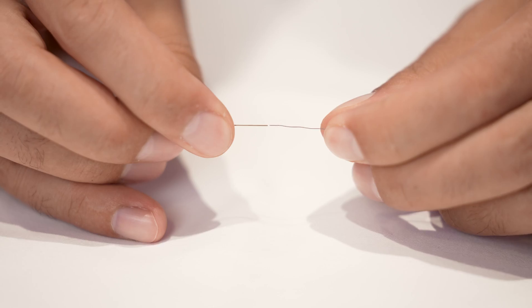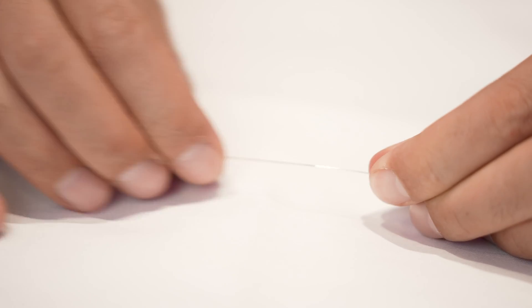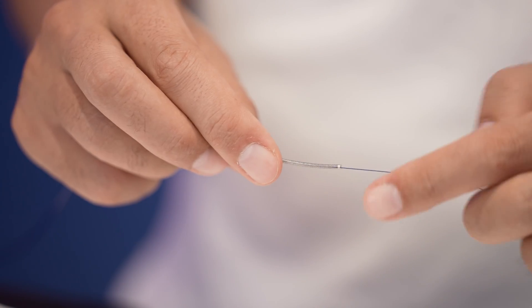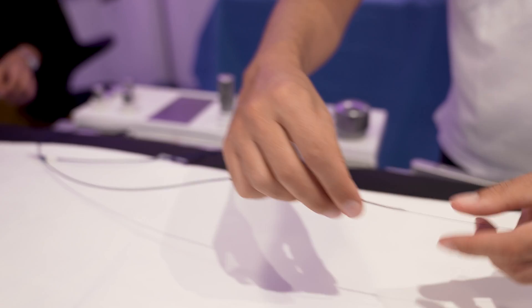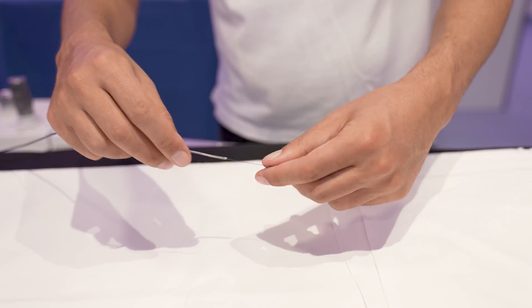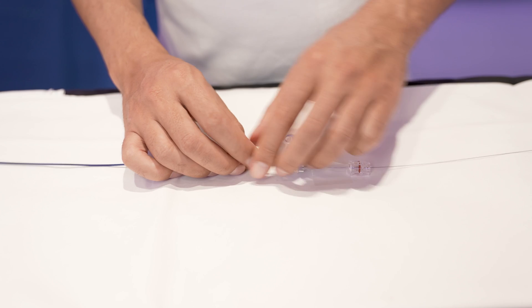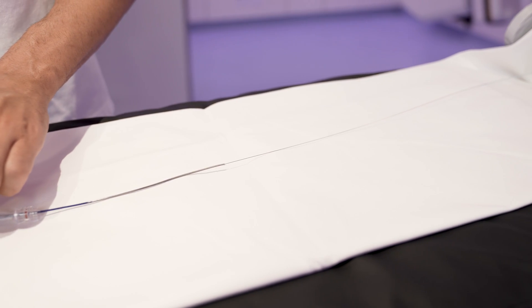That's exactly why we need this extension wire. As you can see, I can now extend my 2-meter stent retriever wire to 3 meters and 15 centimeters. I'm using this extension wire — now it's connected, and it's actually pretty smooth, so even now you can advance other devices over it. The big advantage is that now I can introduce my aspiration catheter over the extension wire. I'll ask my assistant to get a hold of the end of the wire, and as you can see we can now tape the wire there, and I can now safely introduce the aspiration catheter. As I'm pushing, you see there is no force on the wire and we have a stable positioning of the stent retriever in the brain.